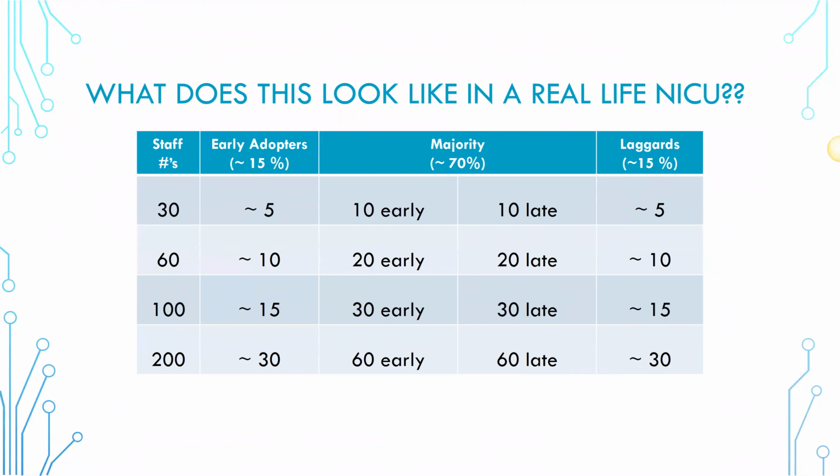And how often will these different people be looking at aEEG? So we've done some quality work at Stanford in the last, probably the last 6 months, for our seizure babies, where we have created a requirement for our medical team to come to the bedside at least every 3 hours and look at the tracing. Yes, the bedside nurse is continuously assessing, as she's doing her things or he's doing their things at the bedside, but it's not enough. We want extra eyes, and so that's an important thing that we've added to our management.